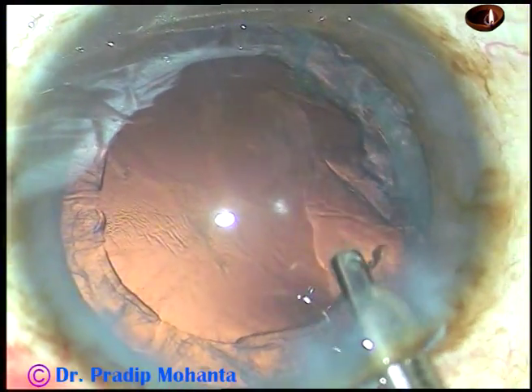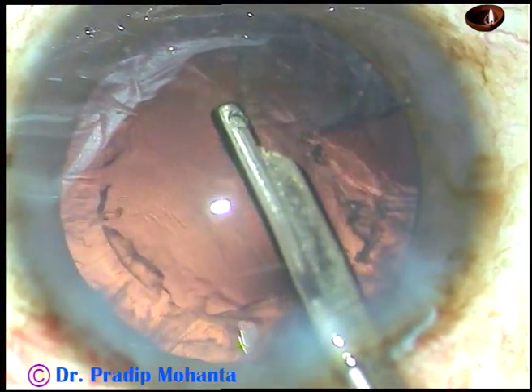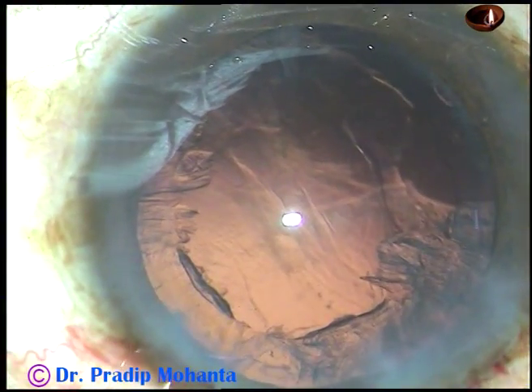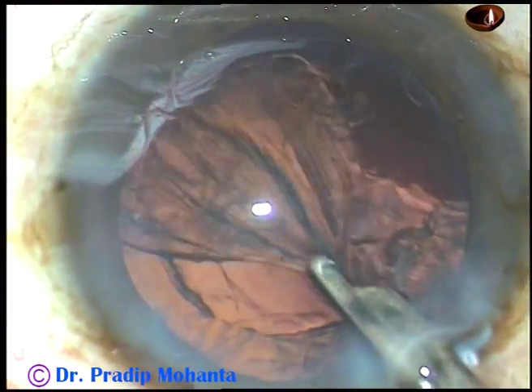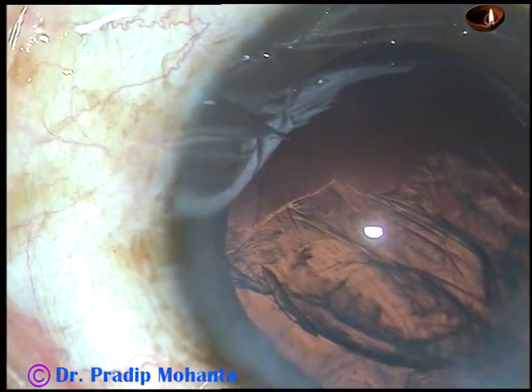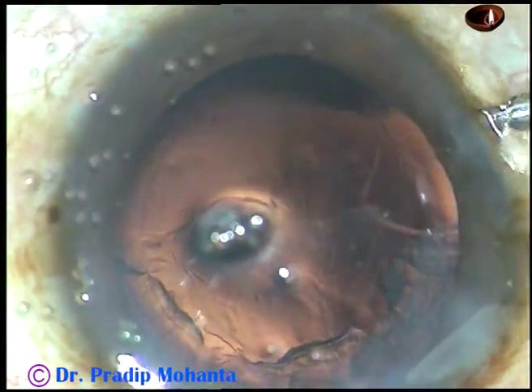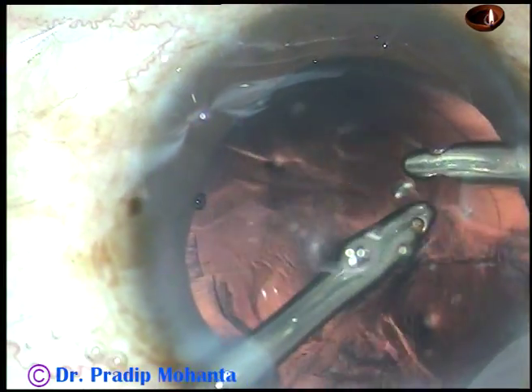Viscoelastic is injected while my assistant gets ready with bimanual irrigation aspiration probes. I use this Simcoe cannula and remove some portion of the cortex. Now the bimanual is ready, so I take the bimanual. Irrigation is through the right side port and aspiration through the left. Now I start removing the cortex.